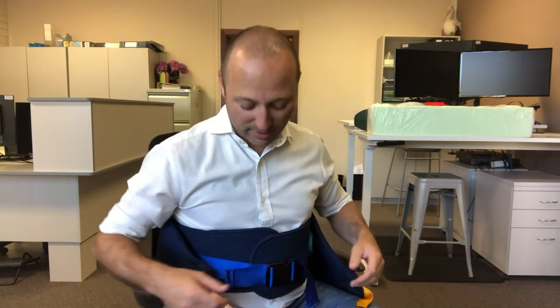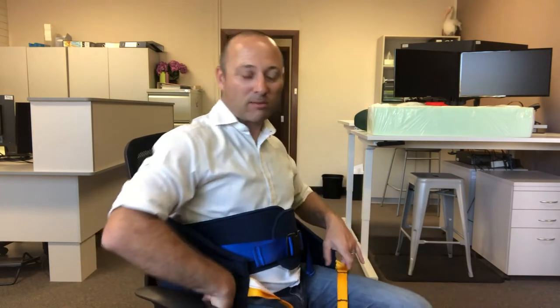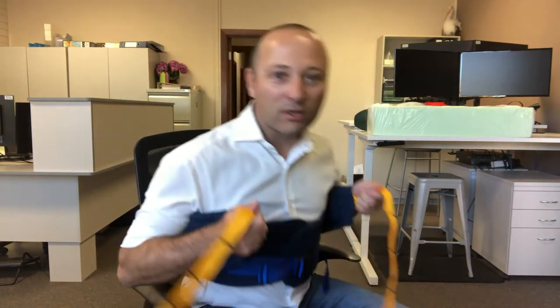Our other stand-up sling in our range has a hook and loop tape belt, and a known issue with those types of slings from us and from our competitors is that once it's fastened when you're sitting down, by the time you're standing up it becomes a bit looser. So obviously if it's hook and loop tape you can't undo that to make it tighter.